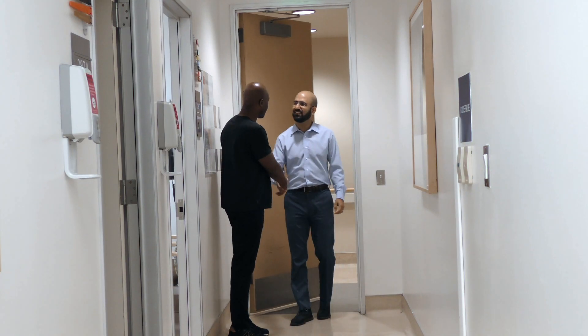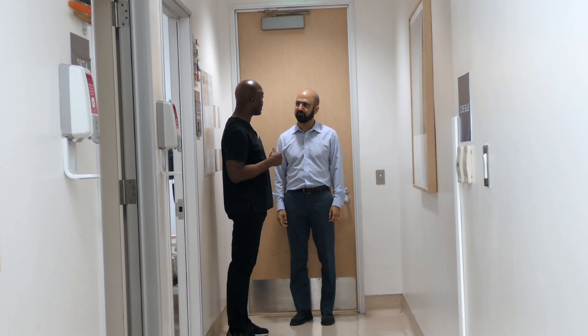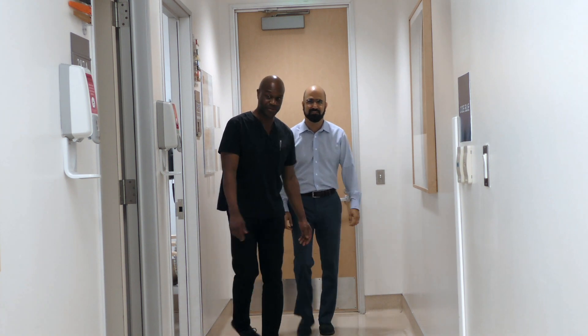Good morning, Mr. Rizzai. How are you today? I'm good, how are you? I'm very well. My name is Jason. I'm the clinical care associate. I'm going to be taking you in for a procedure today. Thank you, Jason. Let's go this way.